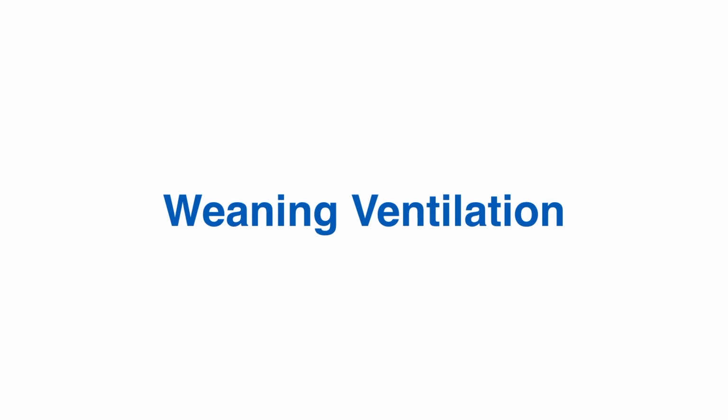The circumstance where you may want to do a gas before another wean is where your patient isn't breathing above the rate. In this circumstance, I wouldn't be turning the rate down in steps of 5, because you'll be swapping 5 big breaths for no breaths.